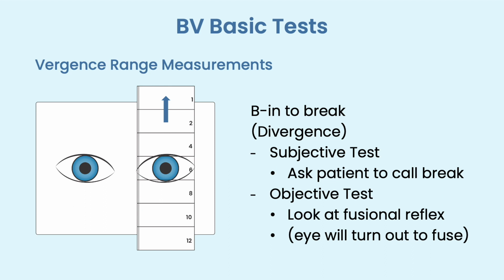We start by having the patient look at the fixation target at 40 centimeters. We then put the lowest amount of prism on the bar, the top prism, which is normally 1 diopter, in front of the eye. We are systematically going to move through every single prism on the prism bar by slowly moving the prism bar up, prism by prism, increasing the Vergence demand, each time asking the patient if the target is still single and checking the compensatory eye movement.